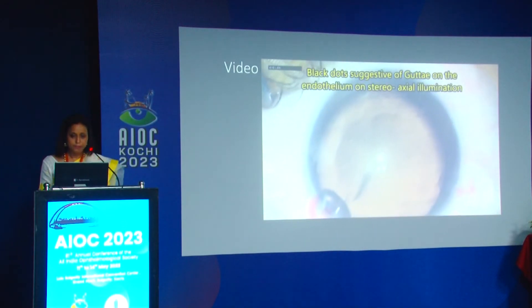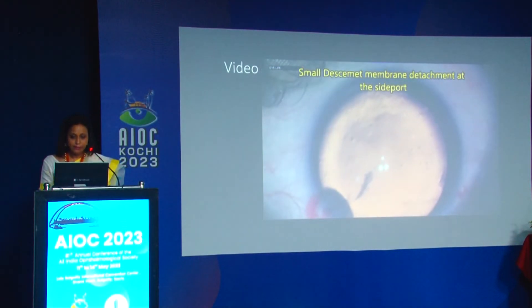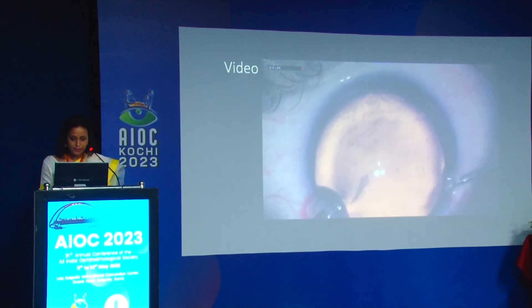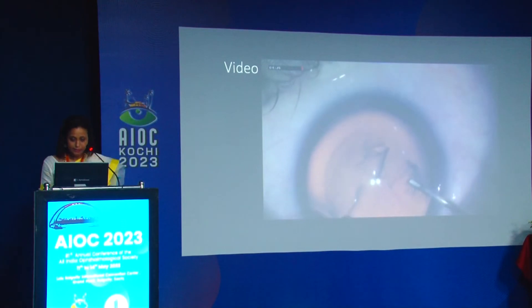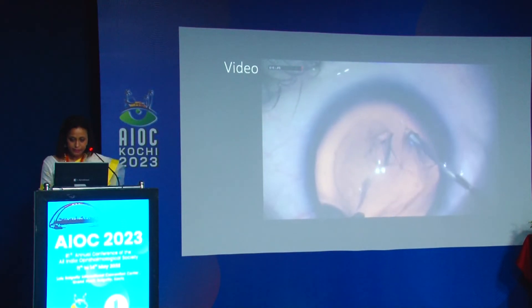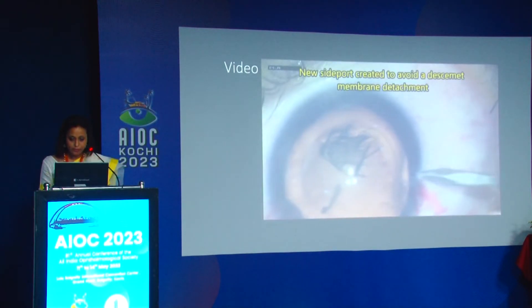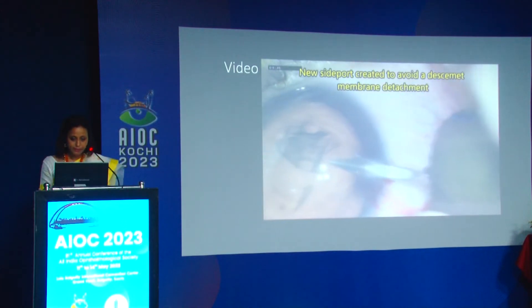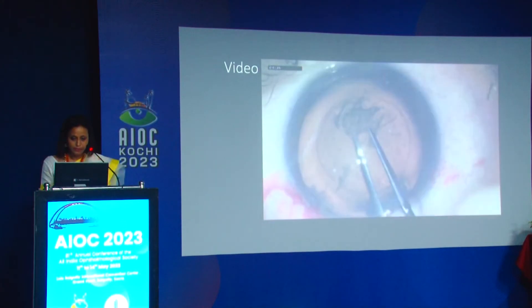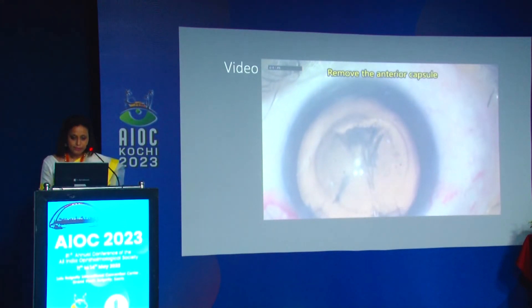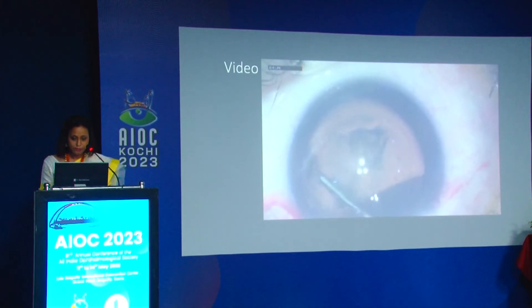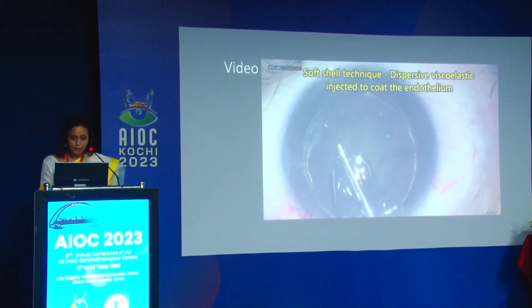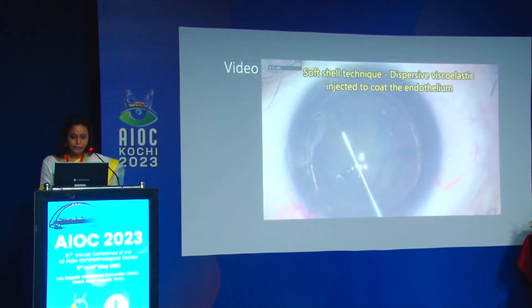As you can see, the black dots in the center are very suggestive of guttae. There was a small Descemet membrane detachment at the entry point, which is not ideal, so good sense prevailed — I made another side port to avoid that area. Once the capsulorhexis is done, we remove the anterior capsule and perform hydrodissection.